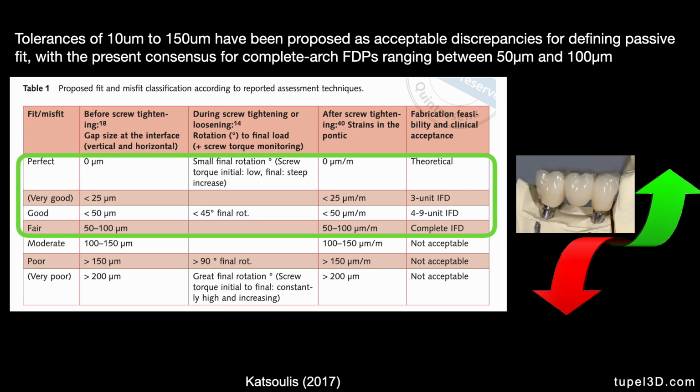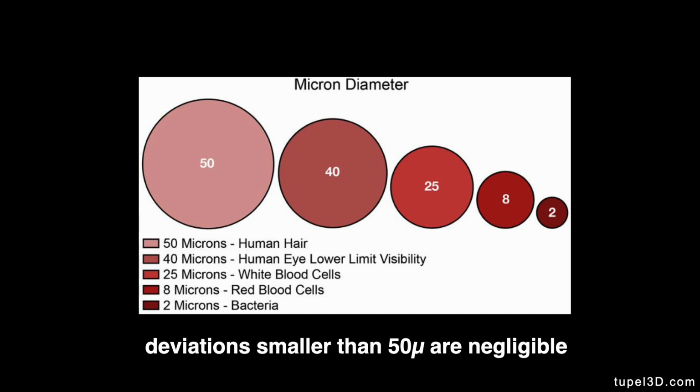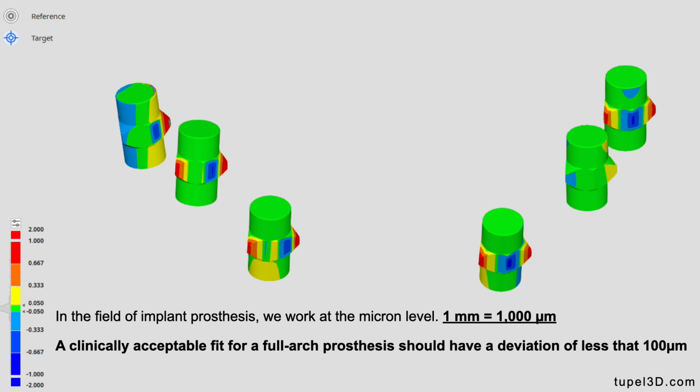We know from the literature that a tolerance of around 10 to 150 micron is acceptable for a definitive passive fit. However, if we have more than 150, you can end up with a misfit. Deviations smaller than 50 micron are negligible, because in full arch implant restorations we work at the micron level. One millimeter is 1000 micron, and in full arch implant restoration, a clinically acceptable fit should have a deviation of less than 100 microns.